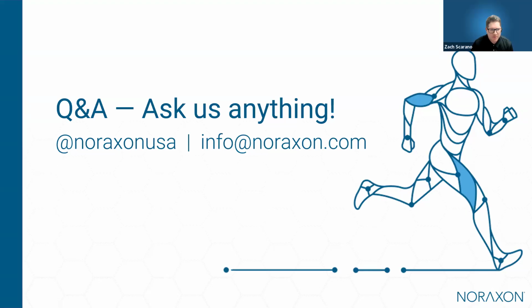In terms of validity, it's typically not how EMG is referenced. Usually, you're using EMG to validate some other aspect, whether that's a movement coordination pattern. The electronics themselves are validated through our certifications.